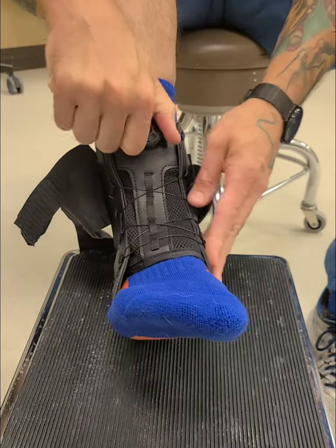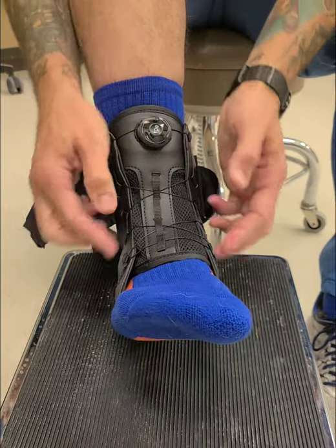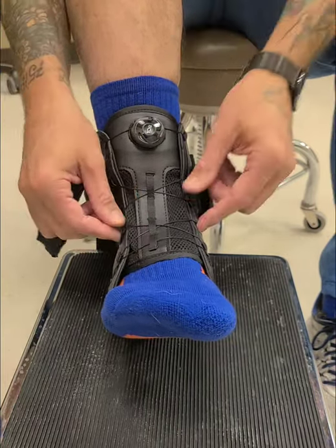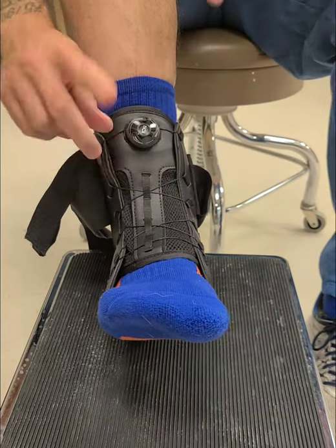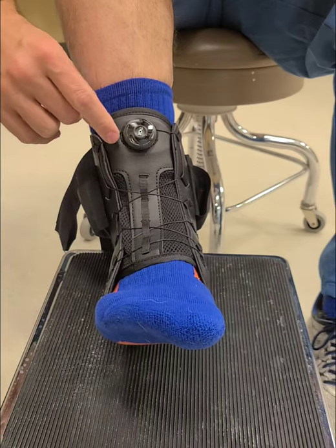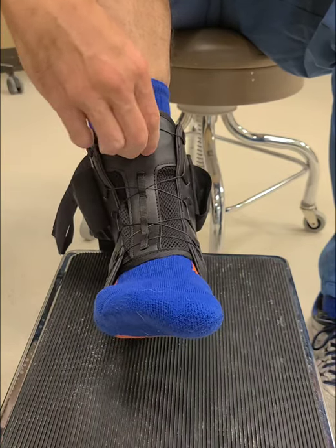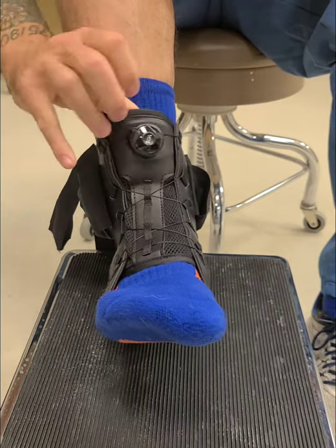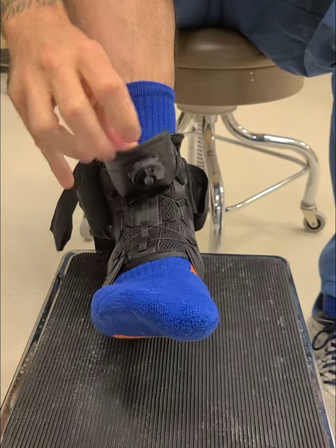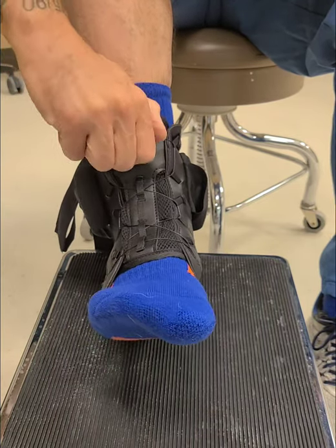Now the little design flaw in this brace unfortunately is that it tightens from the top through this dial, so it's pulling up. If you notice, it's getting kind of snug up here but down here it's really loose, and you can't grab those laces — they're too slippery. A little trick I've found: when it starts to get snug up top and it's still loose down there, go under the tongue, push forward three to four times, then turn the dial. That gets all the slack out from the bottom, pulling it up and out of there.